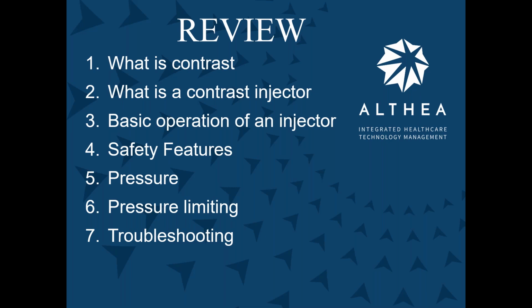Huh? What do you want me to do? Can you decrease your PSI to 200? How do I do that? You push that button and select 200 PSI.